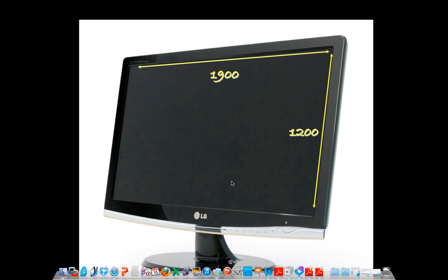Well, what difference does that make? For most of you who are not up on the big screen giving lectures, and even if you are, it doesn't make that big of a difference. You're going to show your stuff to patients on a screen. Now, the average screen nowadays for a good screen in your practice should be about 1900 pixels wide by 1200 pixels down. If you do the math, that adds up to 2.28 million pixels, or megapixels.